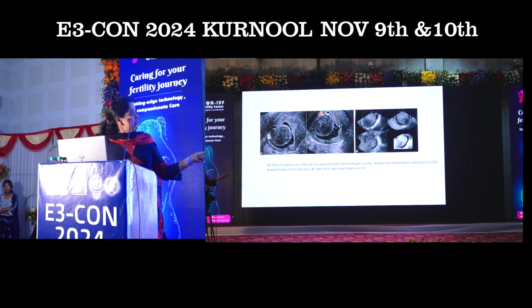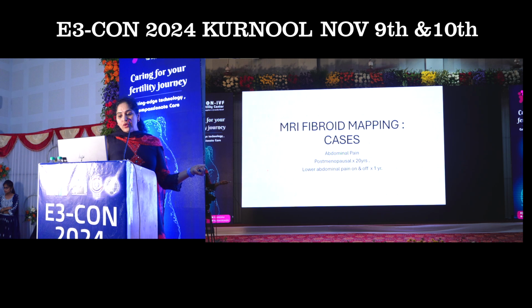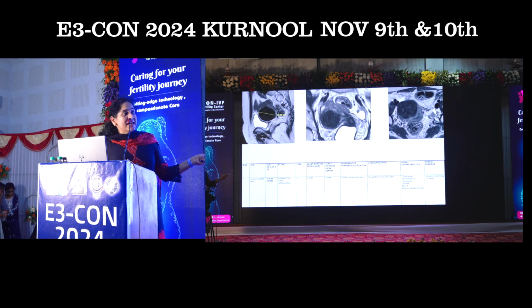And sometimes you can instill saline to enhance the imaging, to better delineate the exact extent of the penetration of the fibroid into the cavity. So what is the role of MRI? MRI will exactly determine the same.